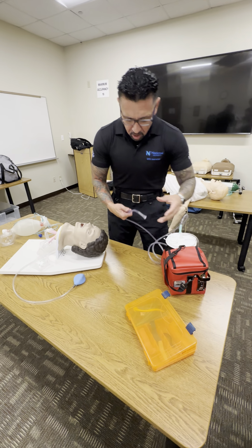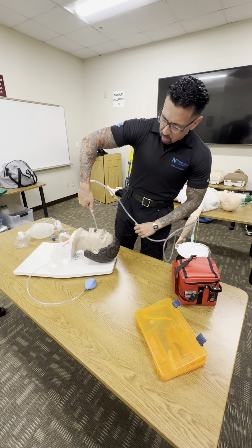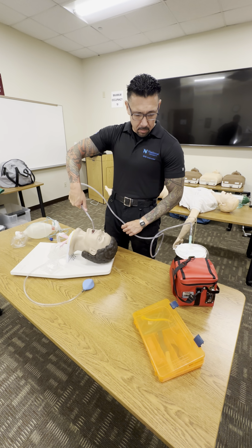I'm gonna turn my oxygen on, make sure it works. It does. I'm going with suction. I'm gonna suction in a circular motion, no more than 10 seconds. The mouth and oropharynx are clear.